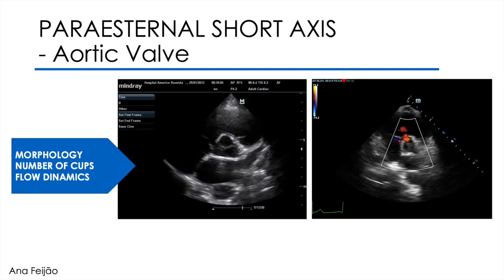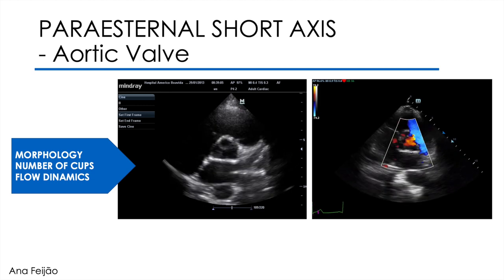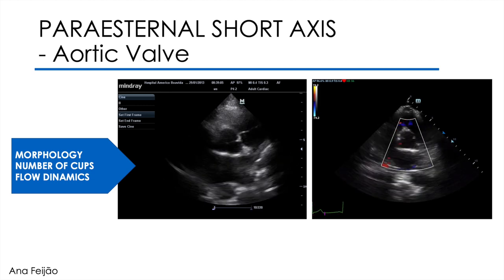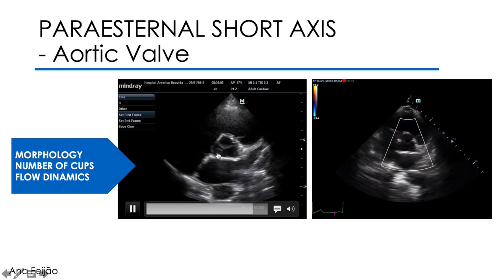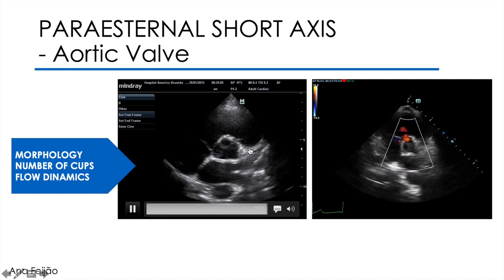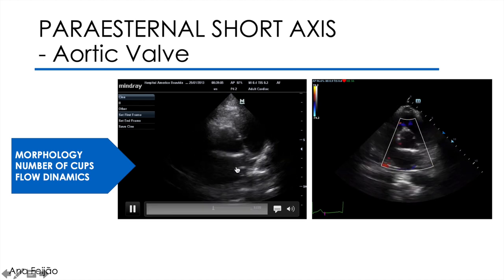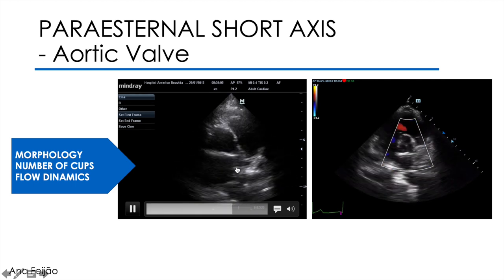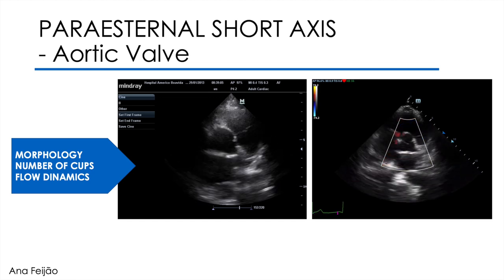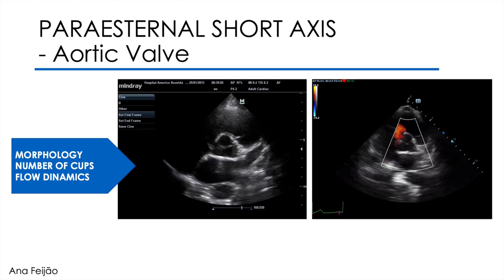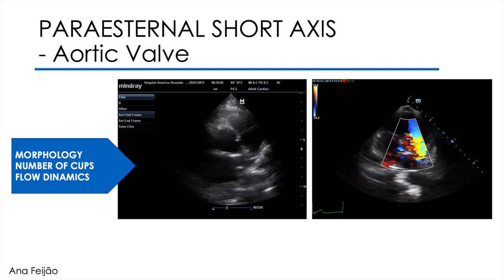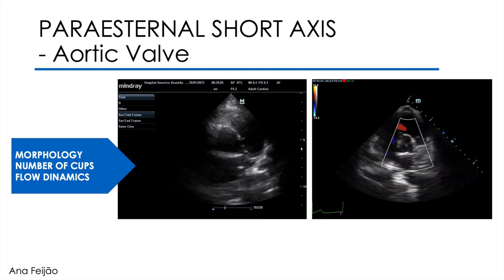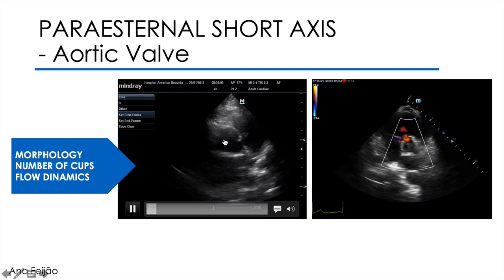Pulmonary valve and pulmonary branches checked. I move on to the analysis of the aortic valve. The aortic valve appears in the center. Sometimes it is difficult to get a good shot to get the three cusps at the same time in systole, but we must do our best to get that image. The first thing to do is to access the opening of the cusps, their morphology — already seen in the longitudinal axis — thickness, and very important, the number of cusps present.